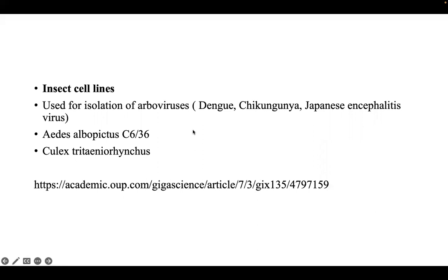Before you use them, you store them at -70 for the longest period of time that you can think of. When you want to use it, you take it out and then use it to isolate and cultivate your virus. But of course, once you've used that particular shell vial, you cannot use it again. So I hope that answers your question, Kefa.